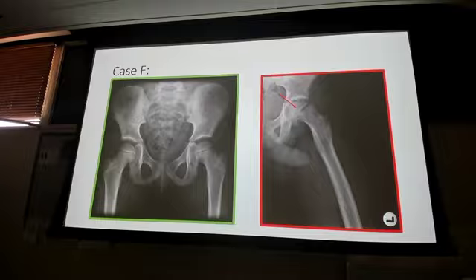But what I will say is that it can be useful sometimes when you're trying to evaluate things. Let's say somebody just throws you a pelvis x-ray, and you're trying to figure out, hey, that looks like a gap in the pubic symphysis, is that normal, is that not? Males should barely have any, females can have a little bit. You can use the soft tissue on a pelvis x-ray to tell you whether this is a male or a female. That is real. But no, it does not always point towards the area of pain.